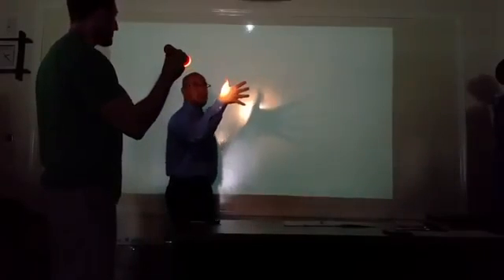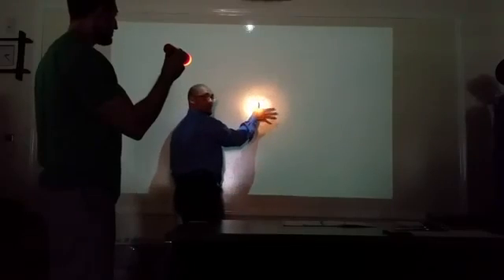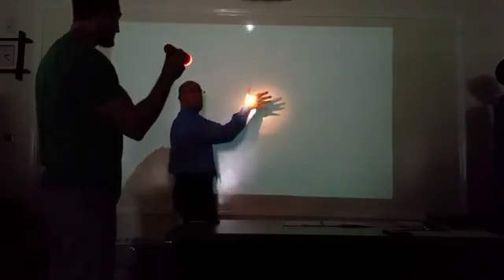So I can decrease magnification by number 1, bringing that further away, increasing your SID. Number 2, if the tube stays the same, what I can do here, and this is the same thing, is increase my source to object distance. The distance from the object to my source is the same thing. I am increasing the distance between my hand and the source. As it gets closer, it gets less detail. The closer my object is to the source, the more magnification and less detail that I have.